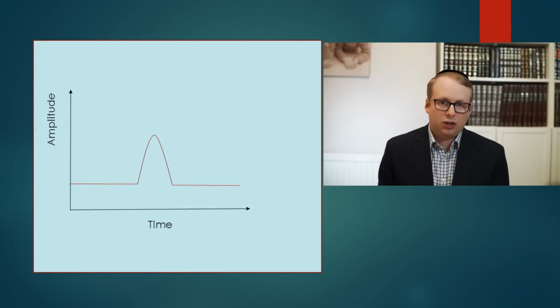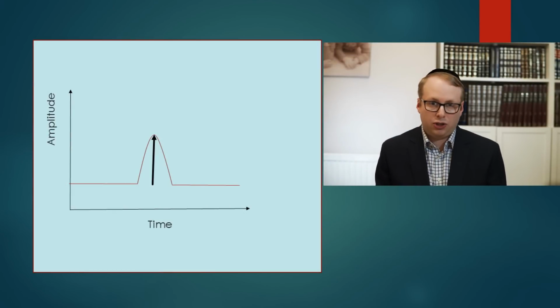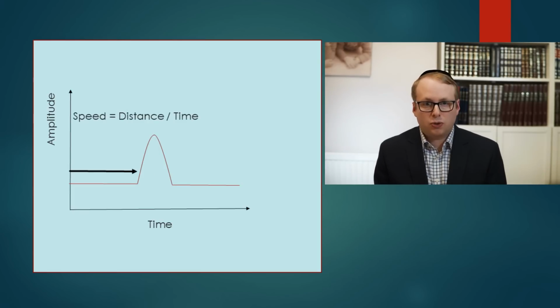For any nerve we measure, the size of the response, called the amplitude, generally reflects the size of the underlying axonal fibres, especially for the sensory nerves, and the speed of the response reflects the degree that the nerve is myelinated. So when the amplitude drops, we generally attribute it to axonal loss. And where the speed of conduction drops, we generally attribute it to demyelination.